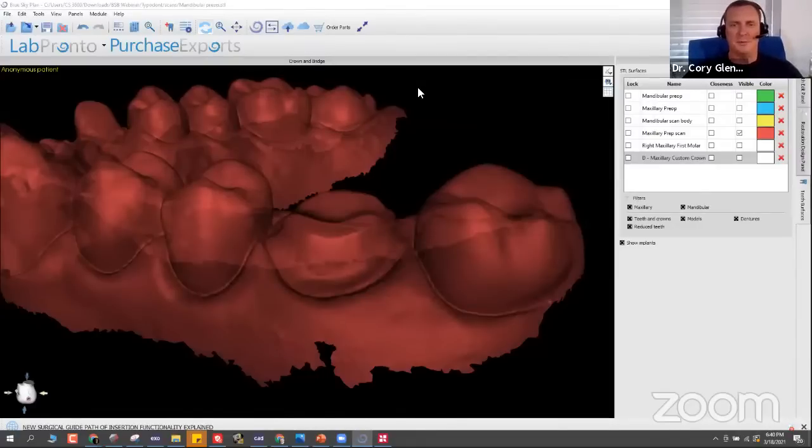Do you have any recommended parameters posted for printing crowns? Well, I do now because this is about to be online, but really there's not much to remember. It will be somewhat printer dependent. For the printers I'm using, which are very accurate, I use a 0.2 cement spacer, and I take the margin thickness down to zero, or 0.1, whatever the lowest you can go is. That's really all you have to do as far as difference between milling versus printing.